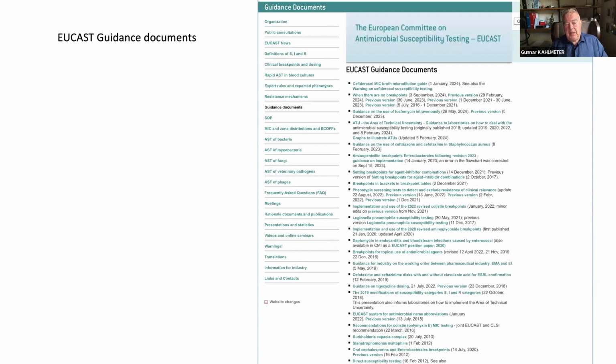I would also urge you to take a look at the list of EUCAST guidance documents. Not everything is suitable for a numerical number. And then it's very important that we can give guidance on how to use tables, what to do.